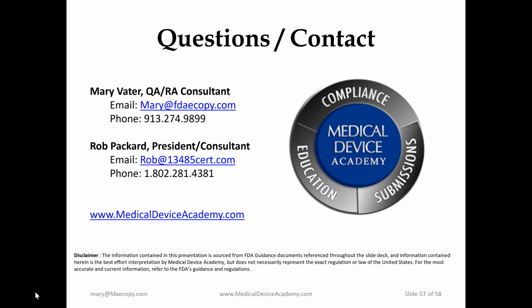And you might even get the surprise of, we also don't think it needs a 510(k), we think it's a letter to file. So going through those steps is really important, and using the special 510(k) process, the pre-sub process prior to doing a special 510(k), is very valuable. But if you need any help with that, that's of course what we do.